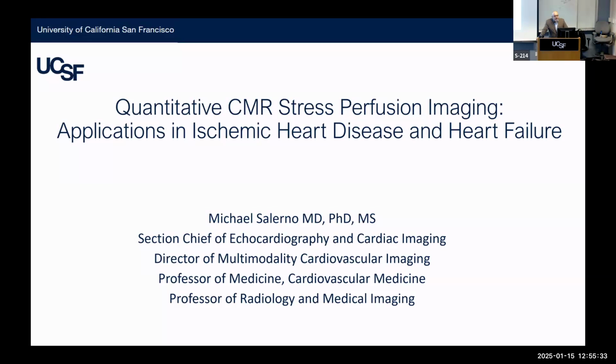And then regarding arrhythmias, with a lot of these techniques we can image 3 slices up to about 120 beats per minute. The image quality is a little bit more challenging with patients who have very abnormal rates in atrial fibrillation, but the test performance is actually still reasonable. People have looked at that before, at least for visual analysis. Quantification is harder because if the heart changes where you are in the cardiac cycle, the size of it will change on the different phases. So it puts a little bit higher burden on motion correction.